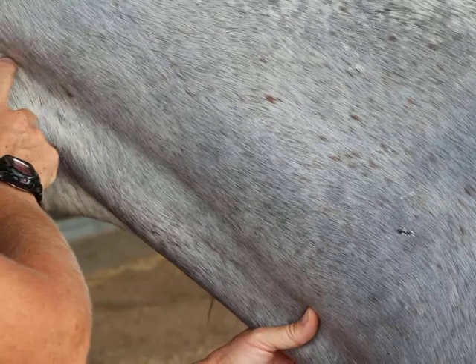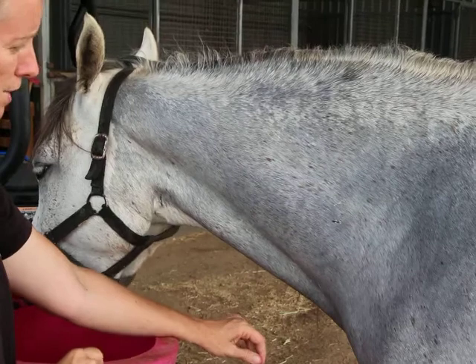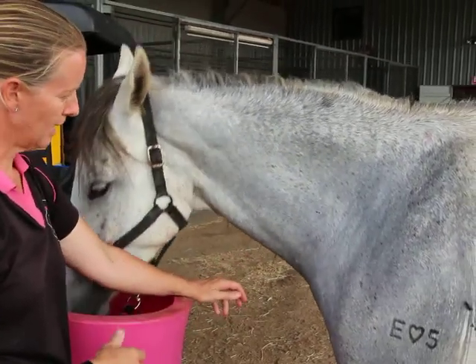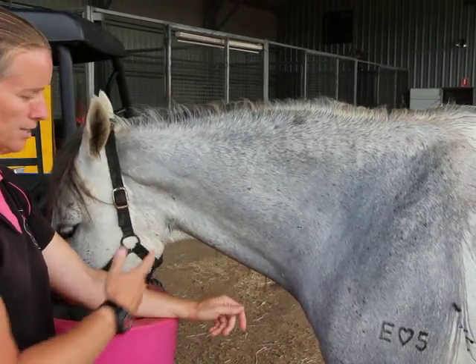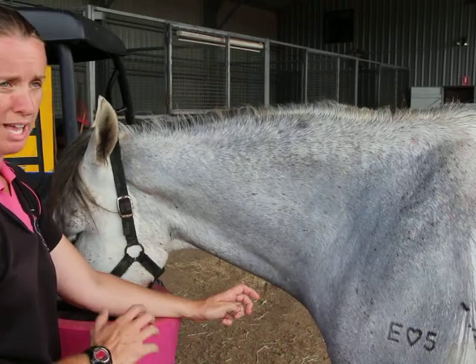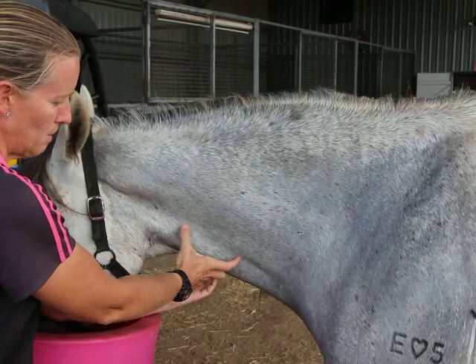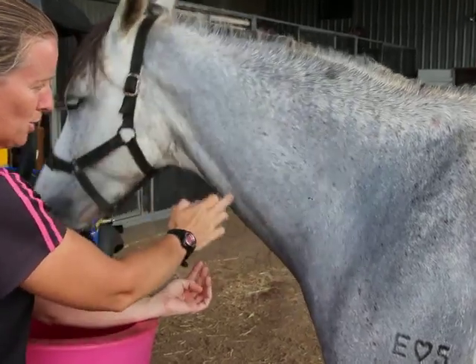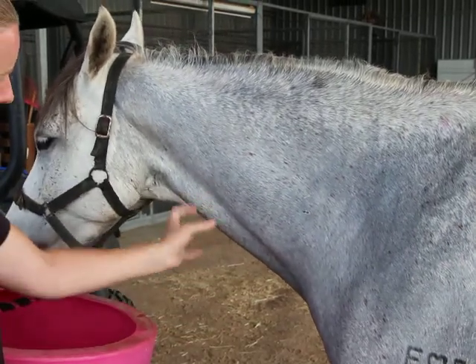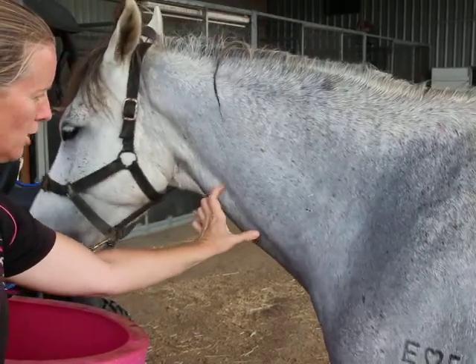You can see it runs from down here and goes up here. If you inject in the top third of the neck, the jugular actually runs very close to what we call the carotid artery — which is an artery, not a vein. If you inject accidentally into the carotid, it's going to go to the brain before it gets synthesized, and your horse will have a very severe reaction and potentially die. So the safest place to inject is the middle third of the neck, because it doesn't run as close to the carotid and the jugular is a bit more superficial in that area.